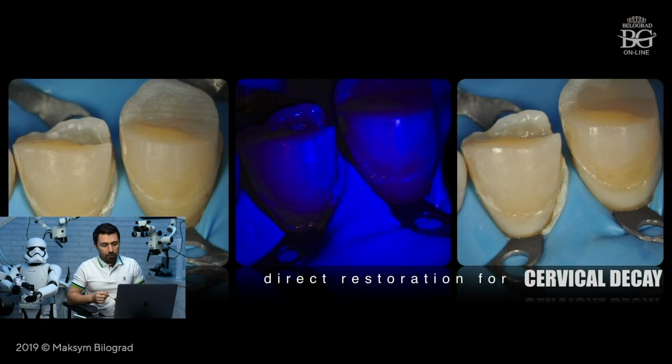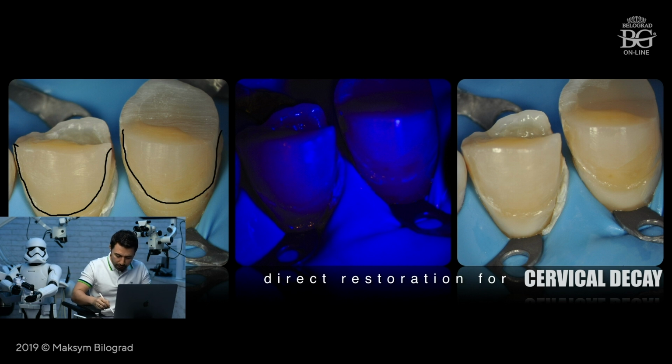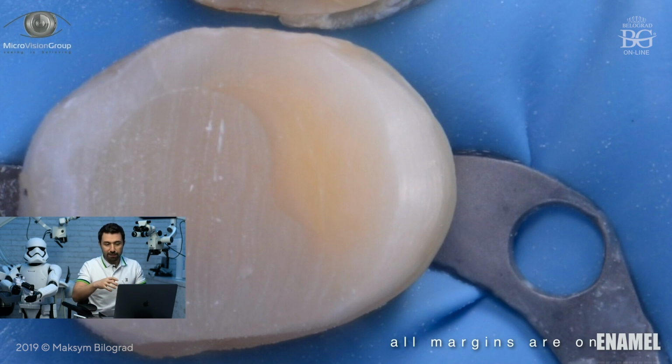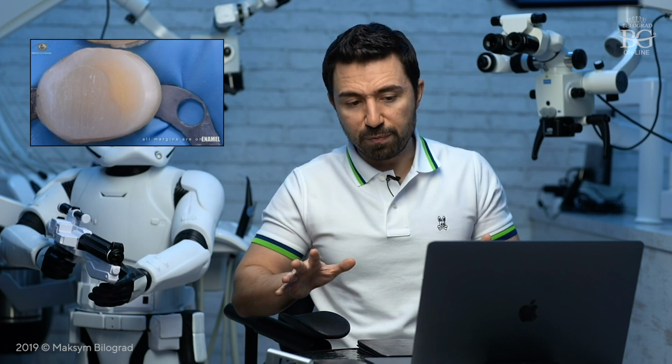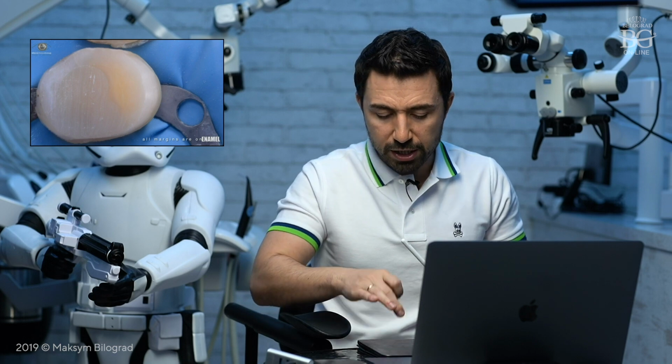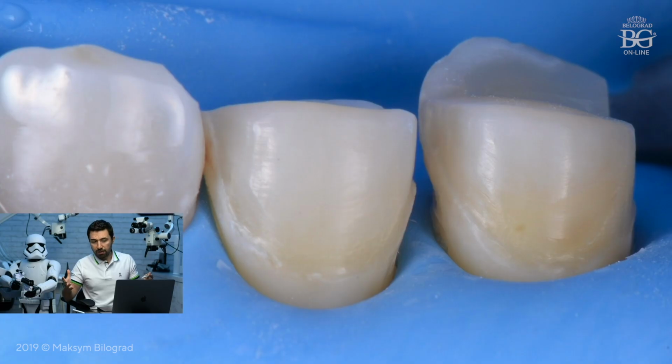This is the sequence of restoration, and again, important, in this case, finish lines were in enamel. So ceramic will be bonded completely to enamel. It will not be bonded to composite, it will be bonded to enamel, okay? Let's go. Here you can see from occlusal view the amount of preparation for that premolar. Pretty super conservative preparation. Everything is in enamel. There is some composite there because of the caries defect, but anyways, pretty conservative. A lot of tons of enamel was preserved.